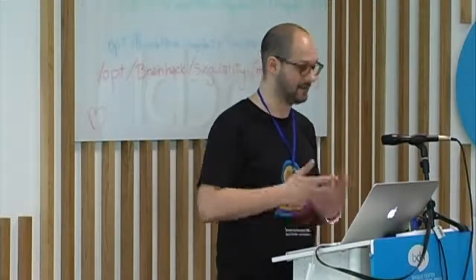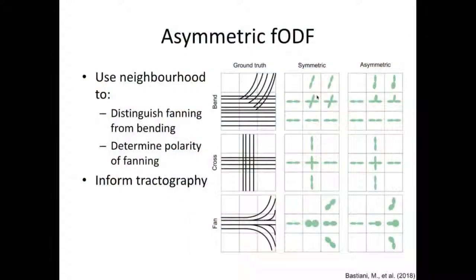No, because again, this goes back to the idea of having an orthonormal basis defined on the sphere, right? So the spherical harmonics basis that we have. So it is a surface. It doesn't get you all the different parameters for the different fiber populations, but it kind of inherently does ARD, like in this example here.